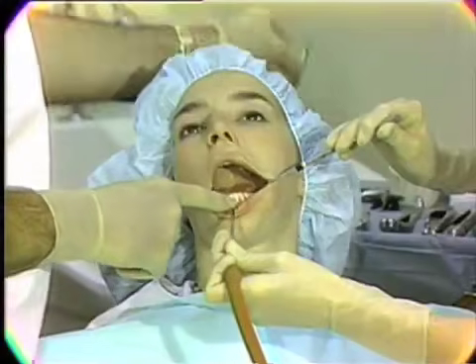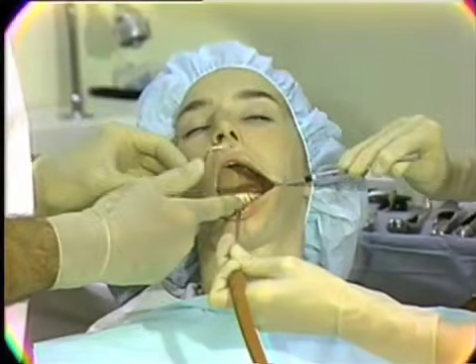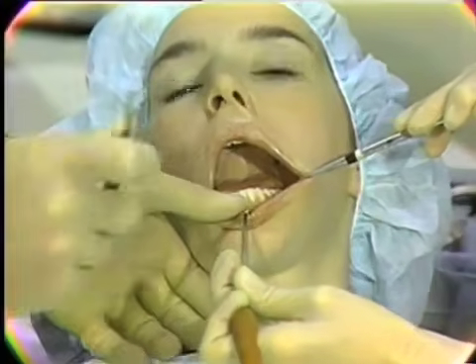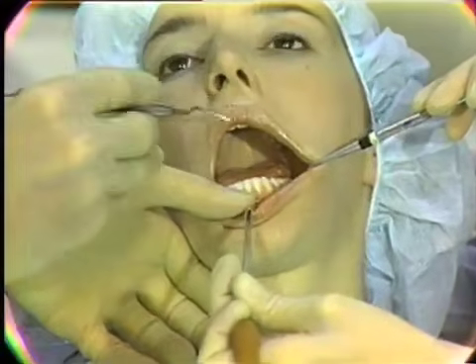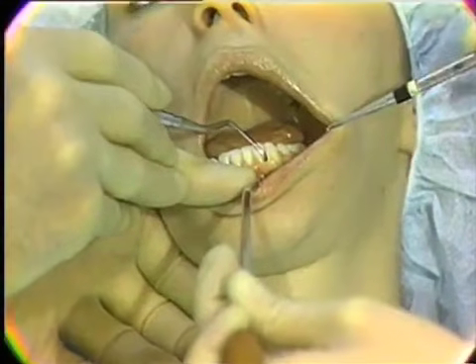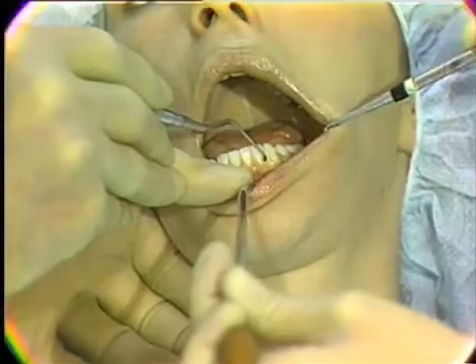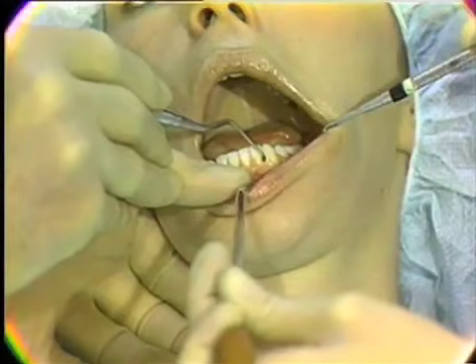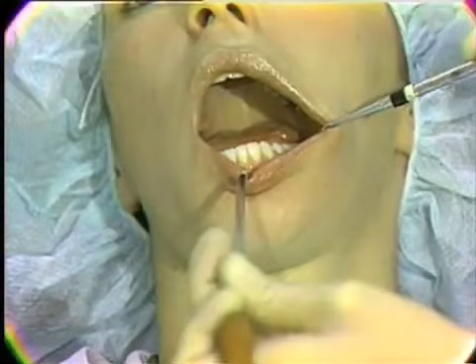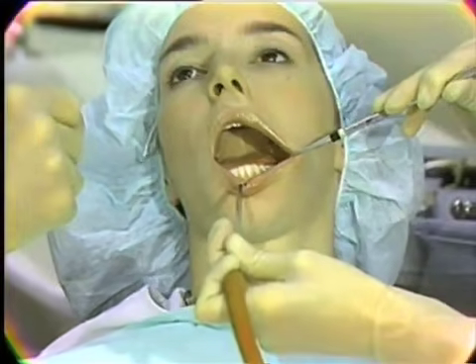After the anesthesia has been administered, we frequently will use a curette to test for soft tissue anesthesia, utilizing it in the free gingival margin area and applying it to test for the lack of any sensation. You can prepare the patient that they will feel some pressure and perhaps hear some noise as instruments are applied, but that they will not feel anything that is sharp.